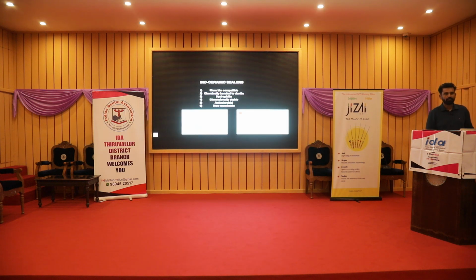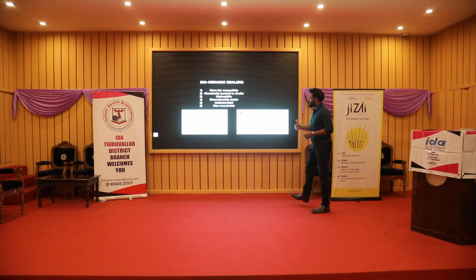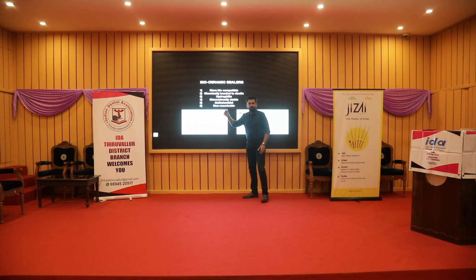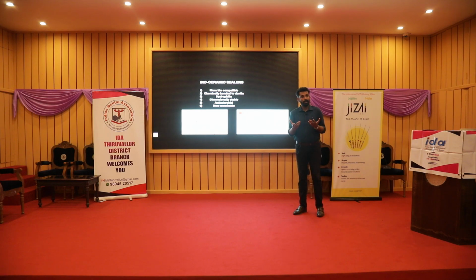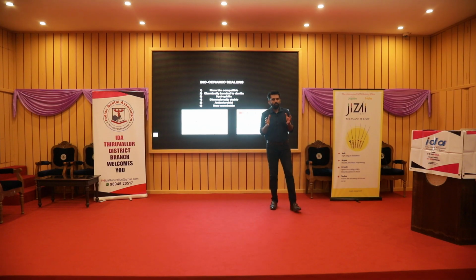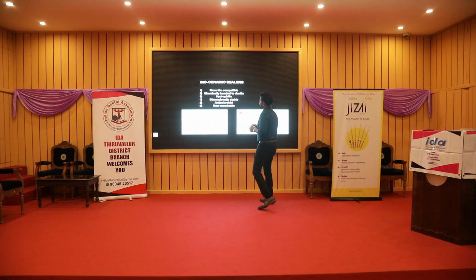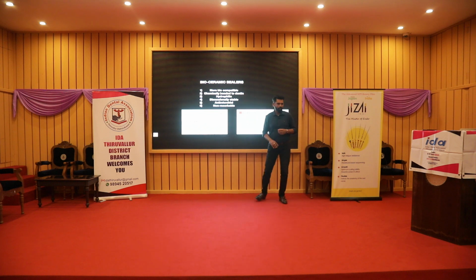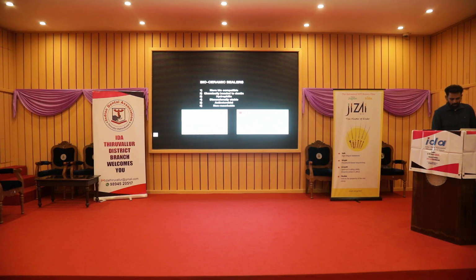Why bioceramic? These are the reasons. It is definitely more biocompatible. It is more hydrophilic; when you compare it with all the other types of sealers, all the others are hydrophobic in nature. It is also dimensionally stable. All other sealers will resorb or shrink over a period of time, so the chances of shrinkage are not there with a bioceramic sealer. So if you can shift to a bioceramic sealer, that will be great.